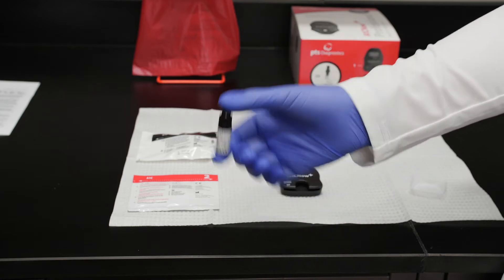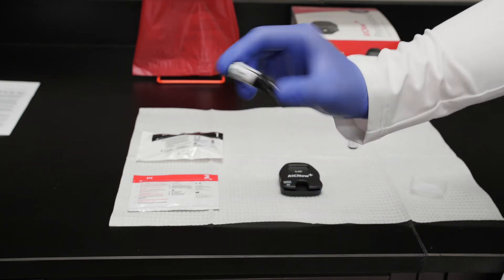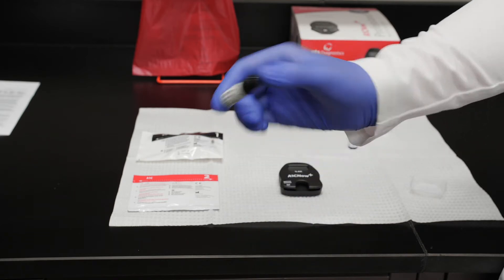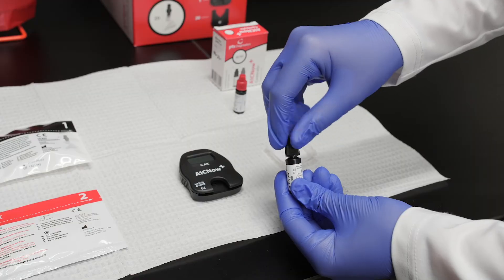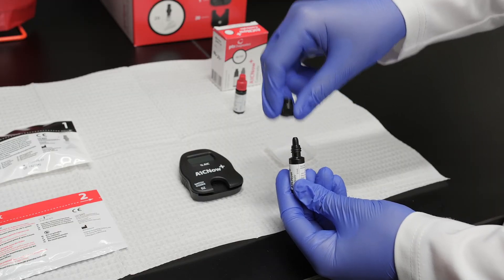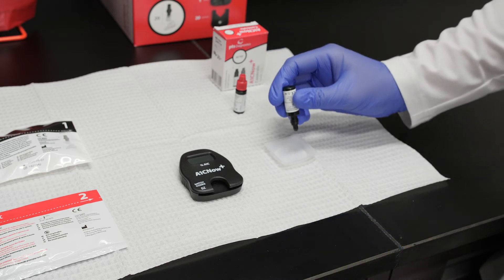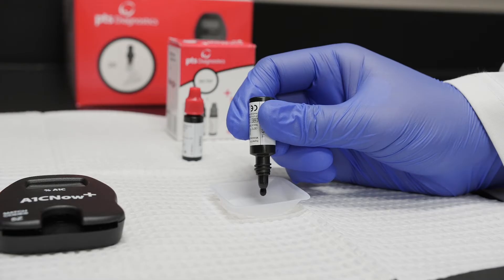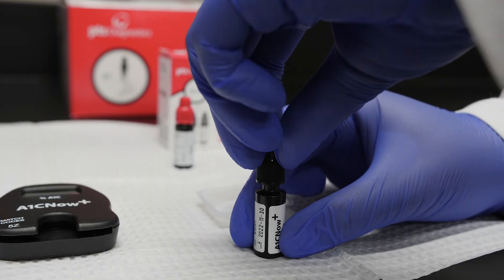To begin, pick up the vial of Level 1 control solution. Gently invert the vial at least 10 times to mix. Do not vigorously shake the vial. Remove the cap and turn the bottle upside down. Carefully squeeze the vial to deliver one drop of control solution onto the clean, flat surface. Immediately replace the lid on the vial.